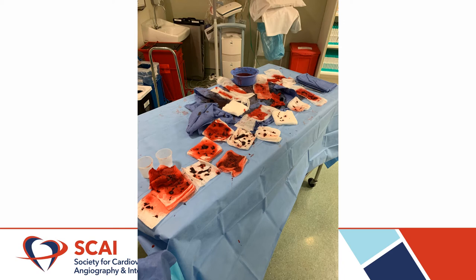We laid out the thrombus extracted on a table. In fact, there was an additional table with an equivalent amount of thrombus retrieved as well.